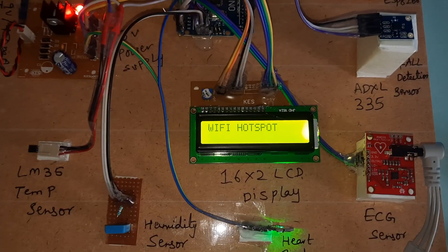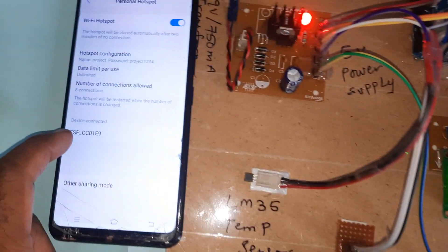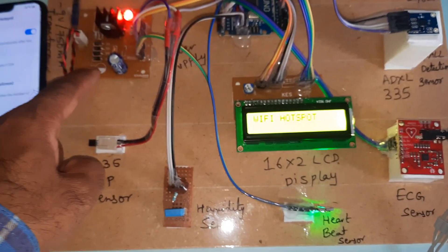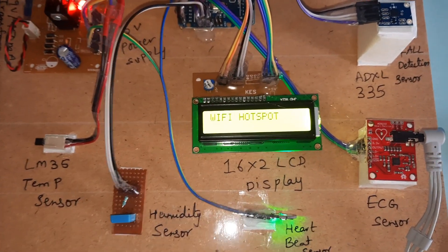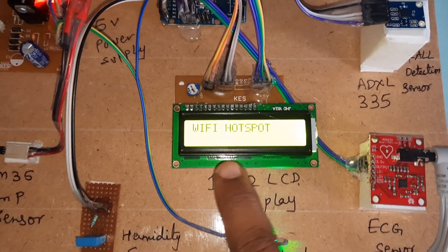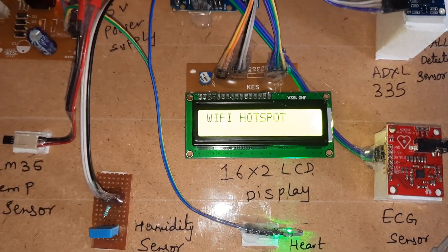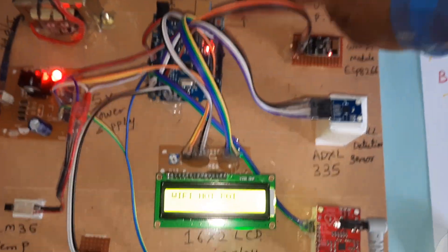The WiFi module is connected with an IP address assigned. The LM35 temperature sensor is active. Pressing the reset button again — it will show that the WiFi hotspot is connected.